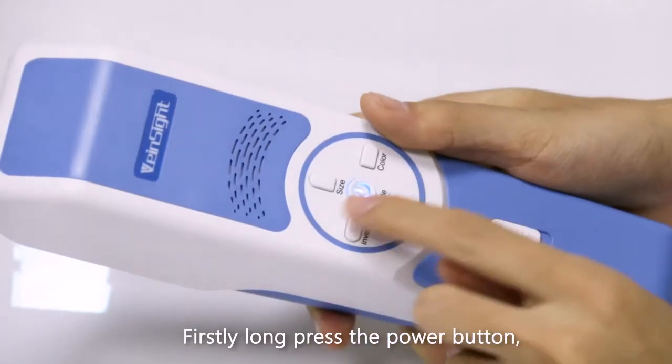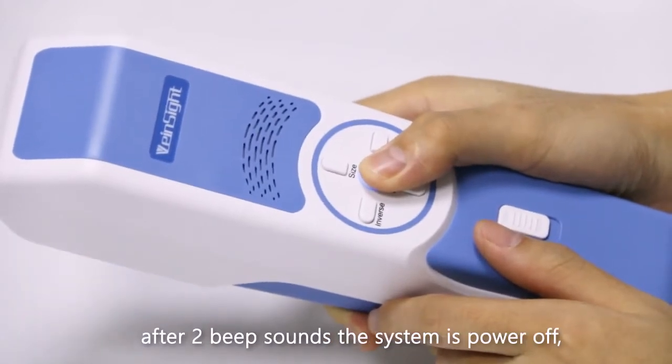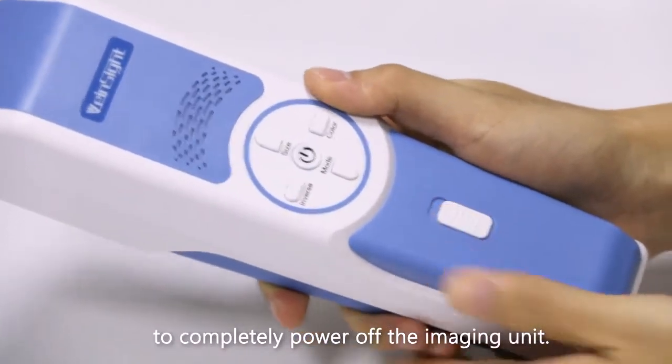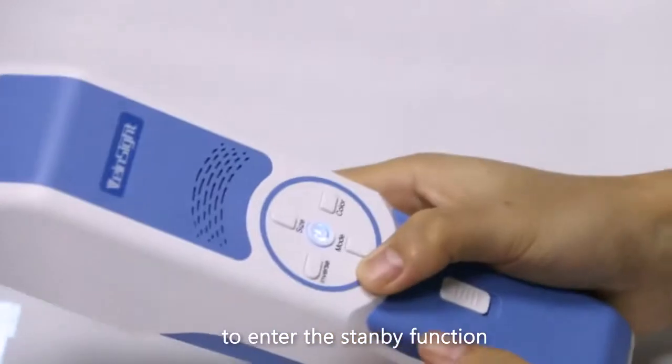To power off, firstly long press the power button. After two beep sounds, the system is powered off. Then turn down the main switch to completely power off the imaging unit.